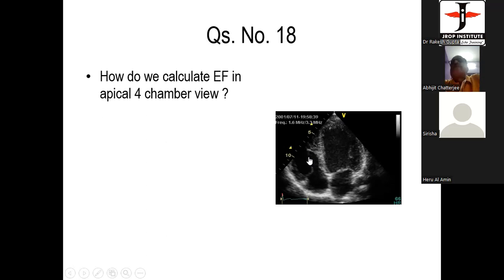Okay. Next person, please, ma'am. Dr. Ishwar Agarwal. Yes, sir. Dr. Agarwal, can you hear me? Yes, sir. See, I want to measure the systolic function of the right ventricle in this patient. Tell me one method by which you can measure the systolic function.